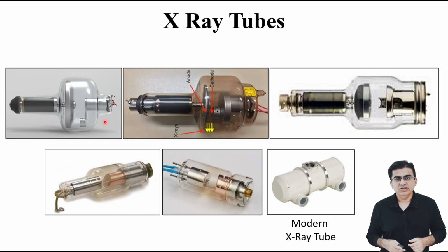These pictures show you exactly how these tubes look from different vendors. Look at the white machine in the right lower corner. This is the most recent and modern design X-ray tube we have these days. This is exactly what is kept inside our modern X-ray diagnostic machines today.